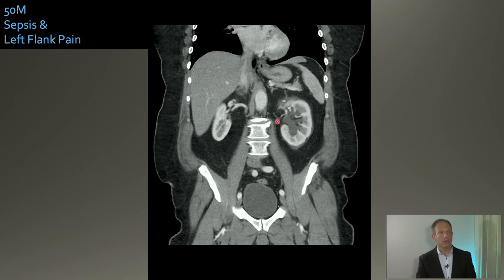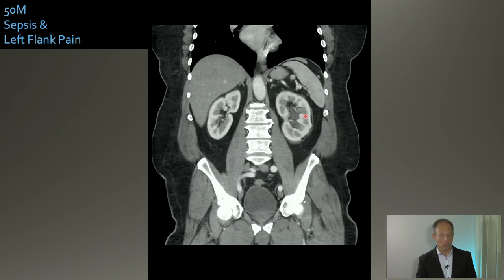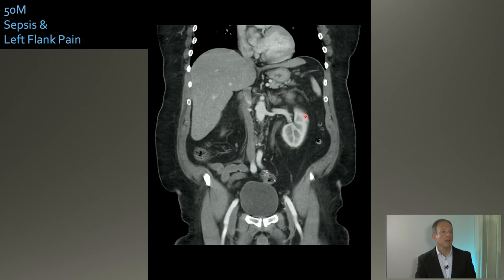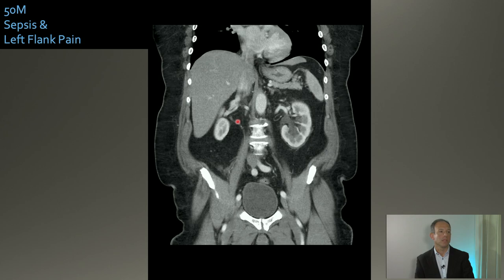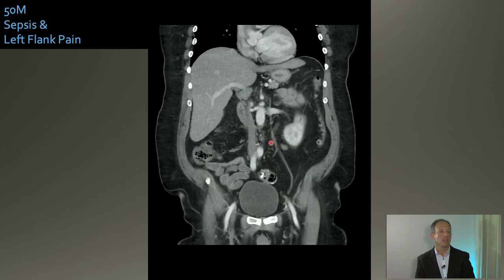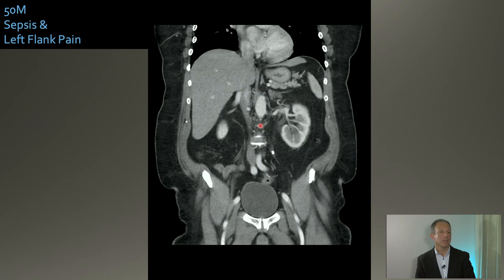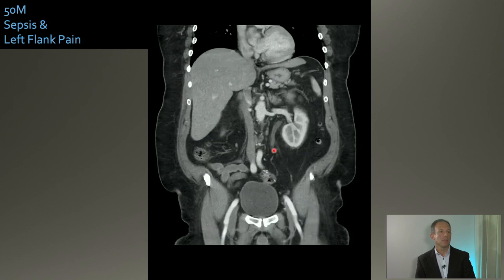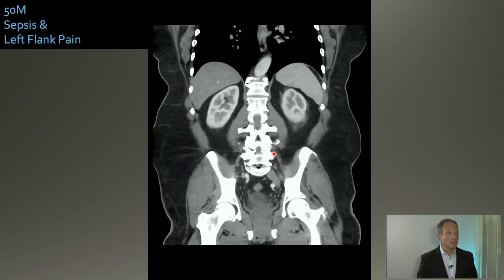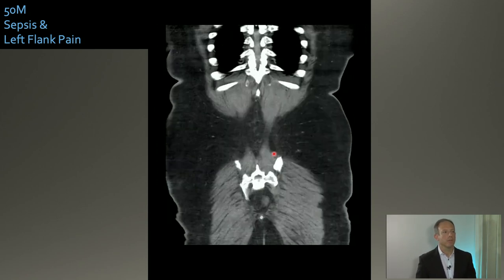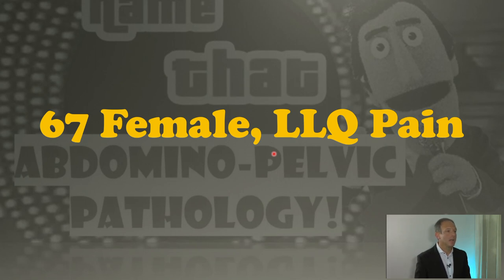Here's the takeoff of the ureter, which is very generous — too big, not the same size as the other one. This one is awfully large. As you come down, you'll see here's your stone. That's an obstructive stone causing severe sepsis and septic shock in a patient — and that's going to change your management.